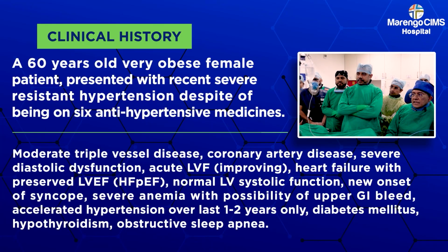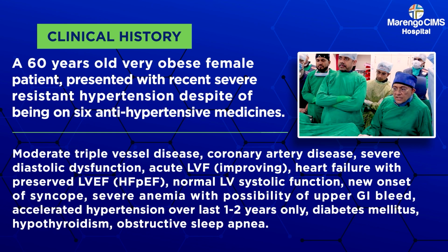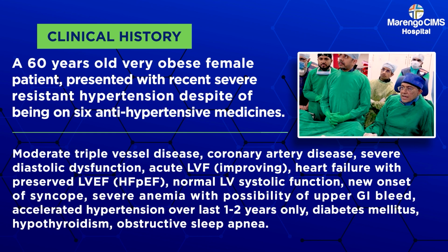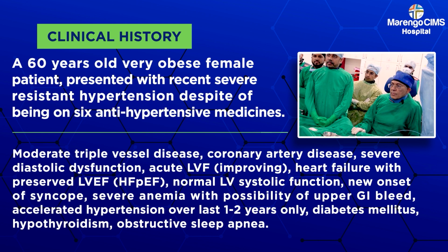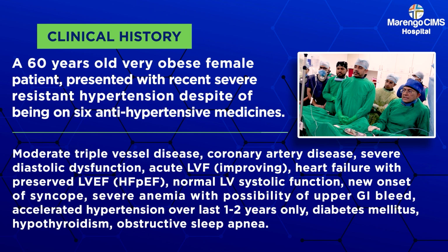We have today a very interesting case, a 60-year-old obese lady who has been my patient for many years, who last couple of years started developing resistant hypertension. She had a routine conventional angiography about a year and a half ago, which showed moderate coronary disease as seen in the slide.